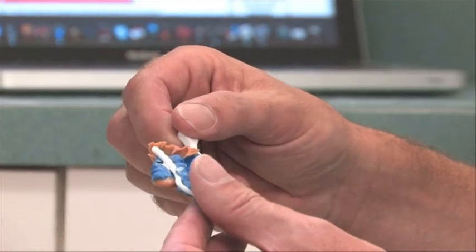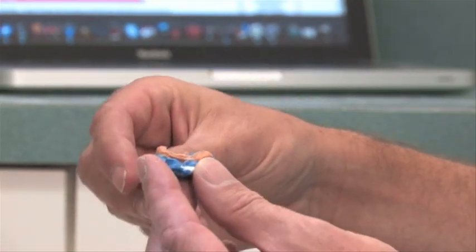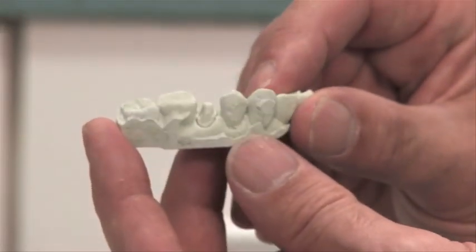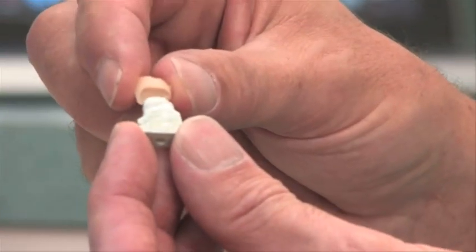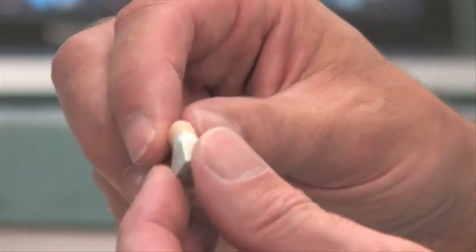Traditionally, we've gone ahead and taken an impression of the patient's tooth after we've prepared it. The laboratory fabricates a model, and then a crown is made that fits the model and comes back. The patient that I did this week — we went ahead and did a few CERECs, but I wasn't totally happy with either, so we did take a conventional crown and bridge impression, sent the patient home with a temporary, and we're here today to fabricate and design a restoration that next week we'll put in his mouth.